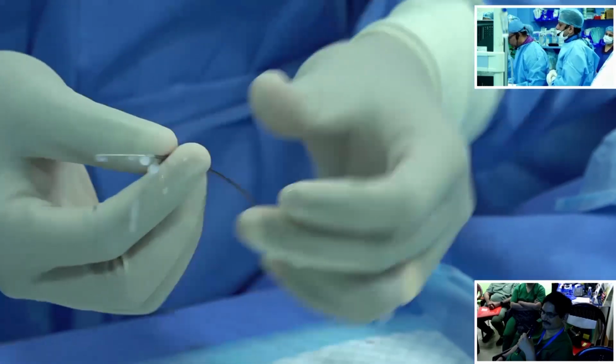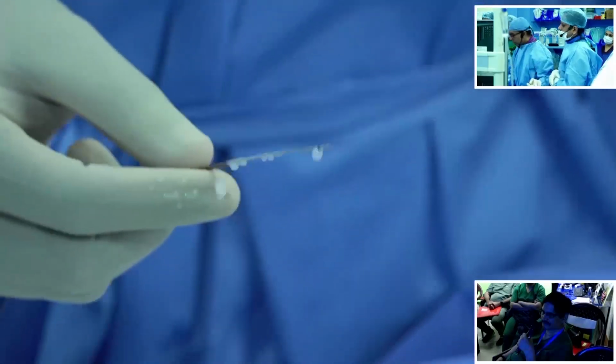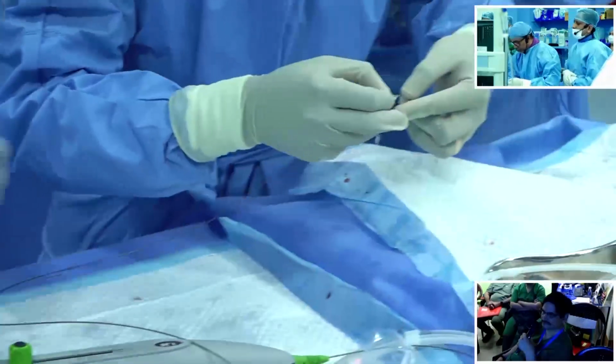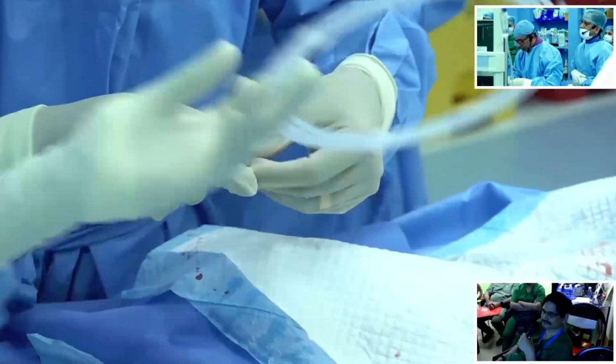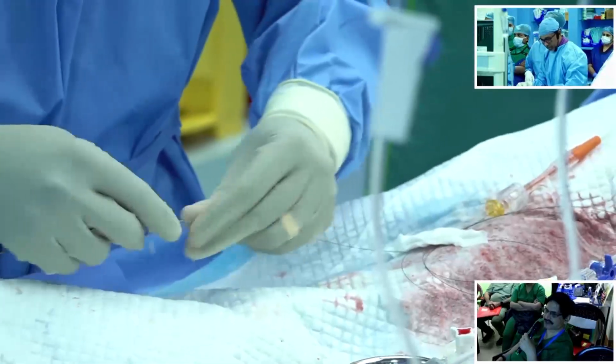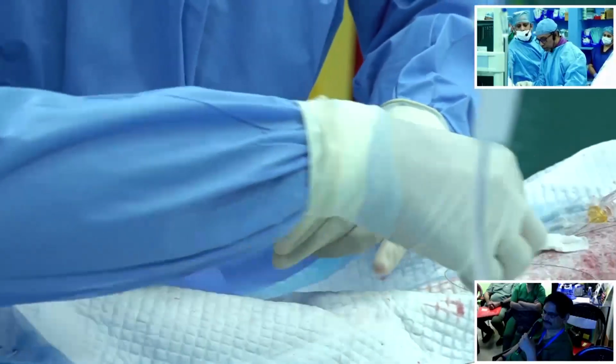Now what we do is we get the orbital atherectomy crown till the Y connector, and then we check a few parameters. Can you focus on to this particular area? The wiper wire is already exchanged. What we have done is we had the workhorse wire inside the coronary.